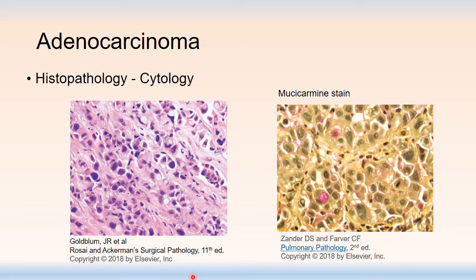If the glandular features don't help you, the cytologic features can. If you ever see an image like this on a test you'd be hard-pressed to identify this as mucin, but if you see a special stain like mucicarmine or a PAS stain demonstrating the presence of intracellular mucin, think about adenocarcinoma.